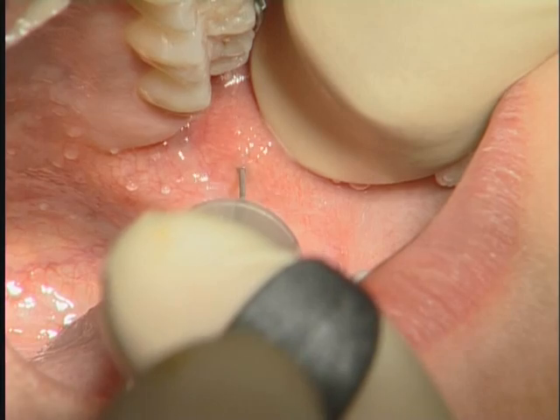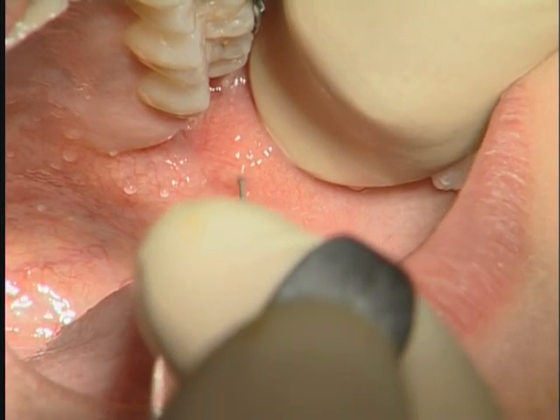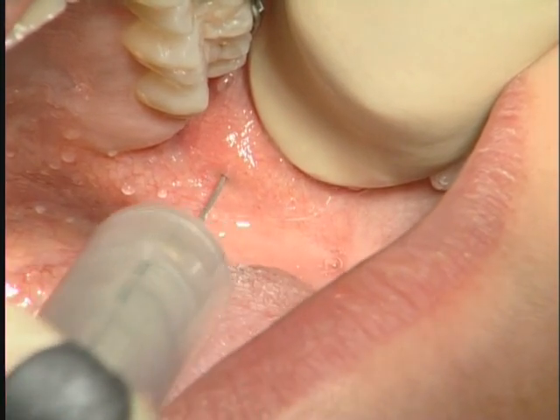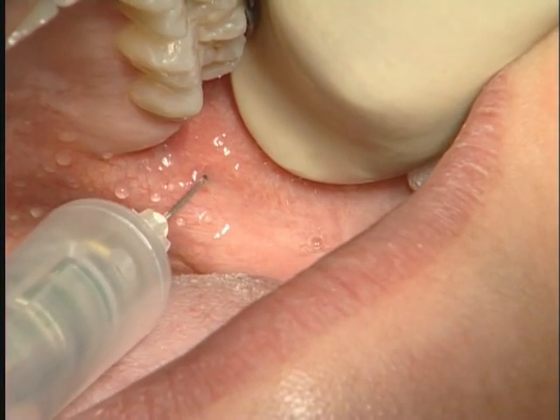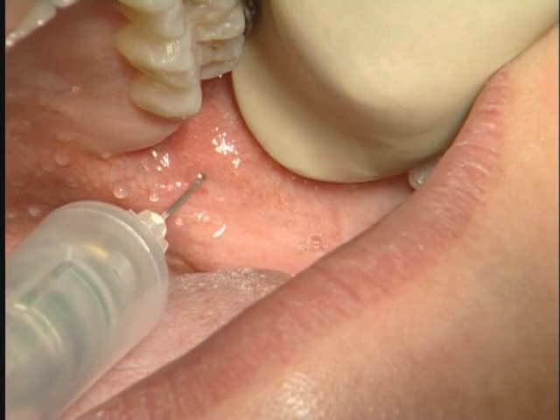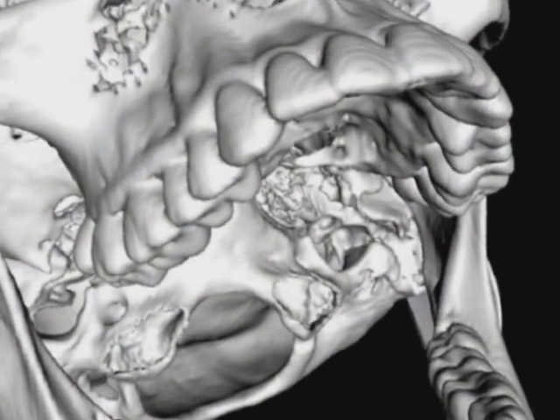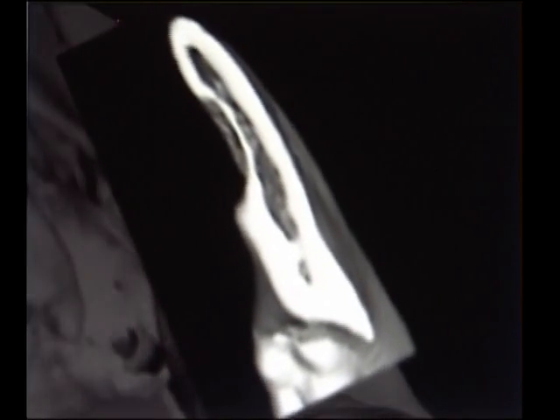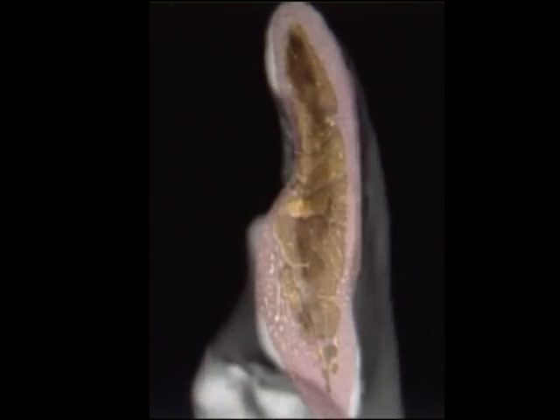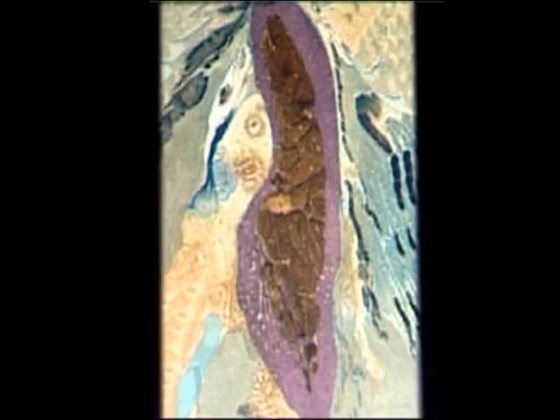When you feel the needle touch the bone, if necessary, you can inject a few drops of anesthetic so that you can reorient the syringe painlessly. Push the needle in deeper by sliding it along the bone, thus avoiding the lingual nerve and the inferior alveolar nerve. When the needle has penetrated 20 mm, you often feel a loss of contact. This means it is in the right position, so you do not need to adjust the penetration depth to 25 mm.